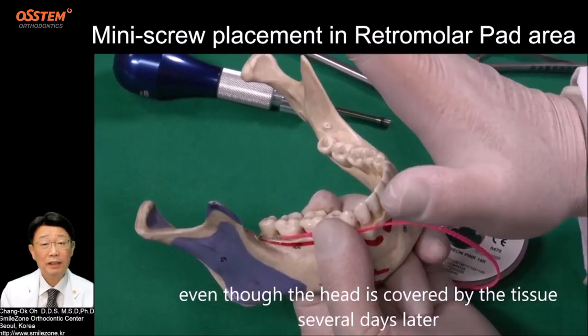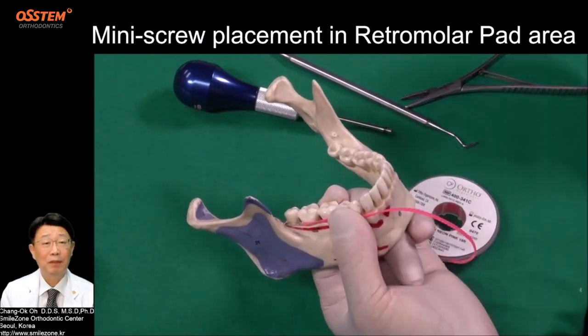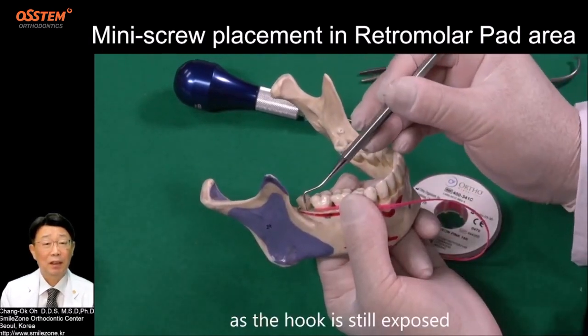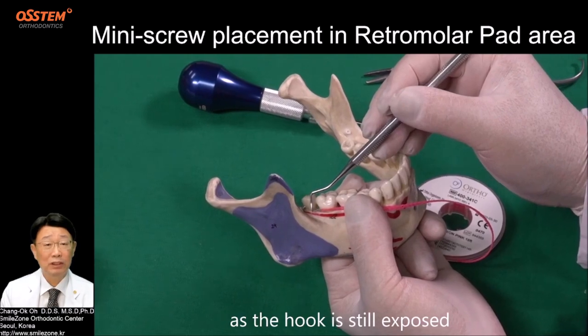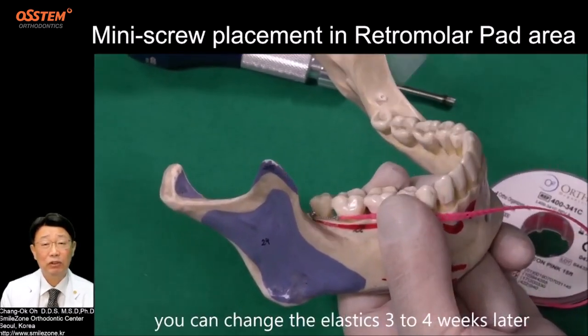Even though the head is covered by the tissue several days later, as the hook is still exposed, you can change the elastic 3 to 4 weeks later.